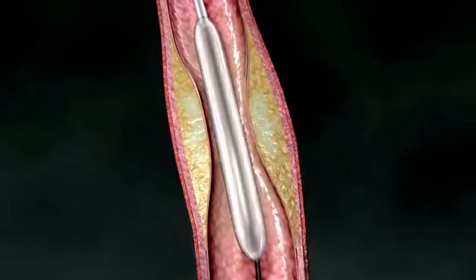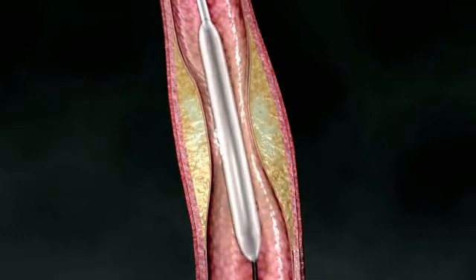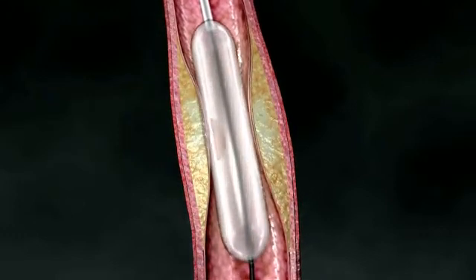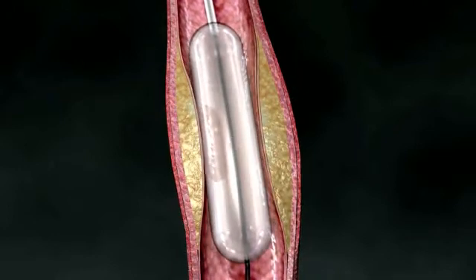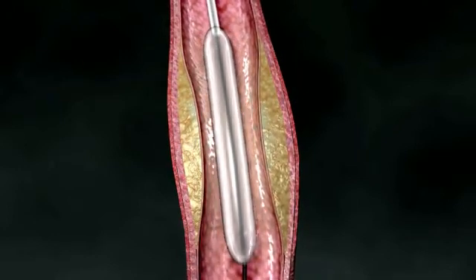When the catheter reaches the blockage, the balloon is inflated, pushing the artery open and widening the blood vessel enough to increase the flow of blood and nutrients to the heart.